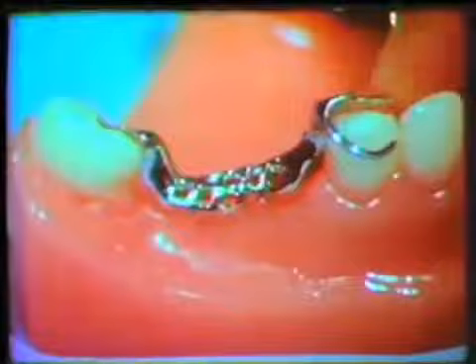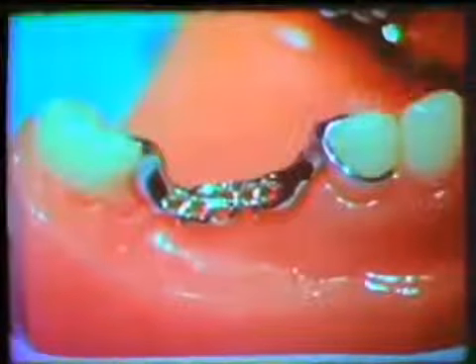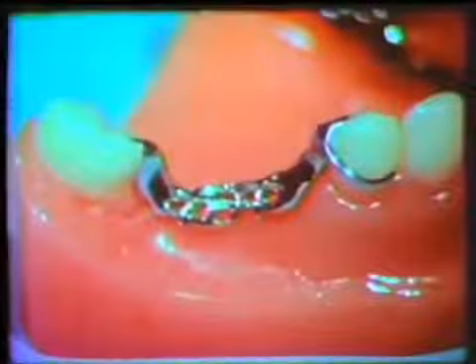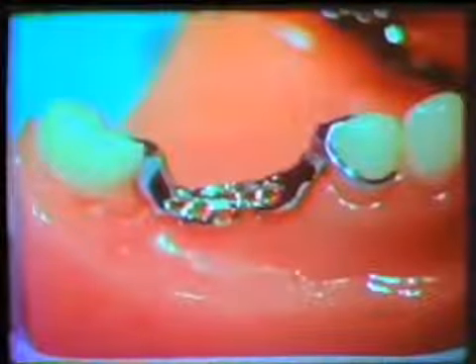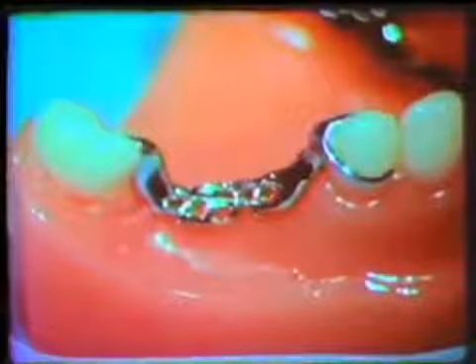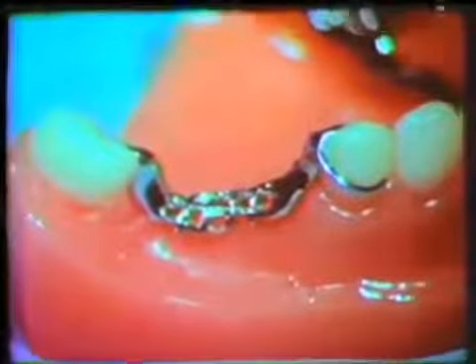When seating the completed framework, the distal most ends of the molar rests are placed in position first. Then the clasps on the anterior abutments are seated. Notice that the inferior portion of the anterior minor connectors will follow a curved path, which is dictated by the posterior rotational centers. Therefore, the blockout in this area must be accomplished as described in order that the framework can be seated without interference.